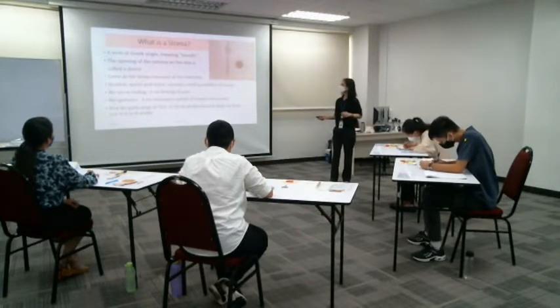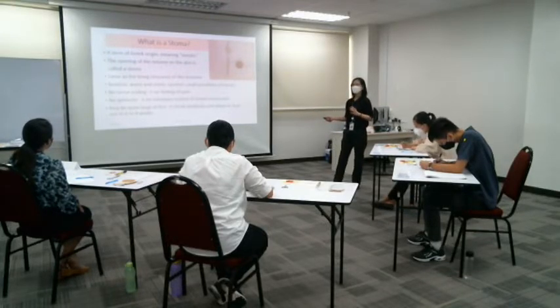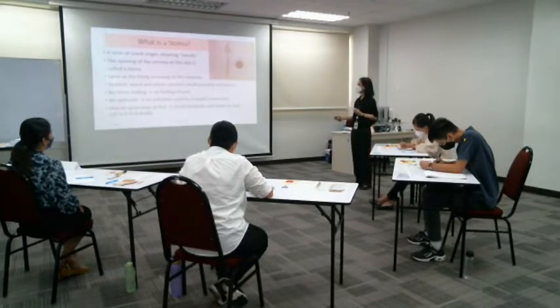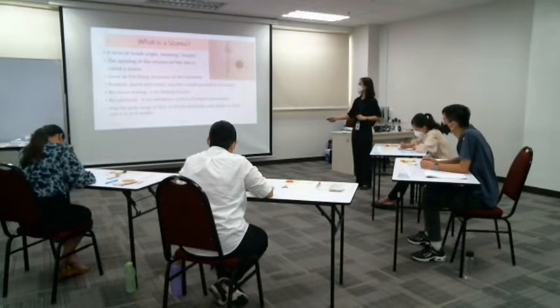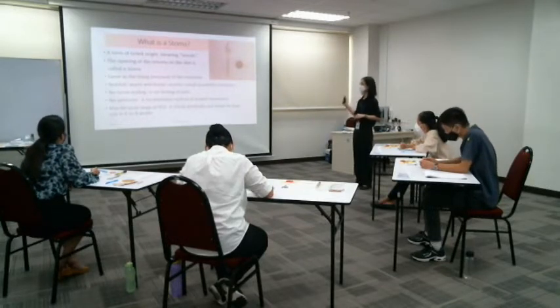The structure of it is the same as the inner lining of the intestine. It is reddish in color, so you can see clearly here. A very nice stoma, with reddish color, and it should be warm and moist, and it secretes a small amount of mucus. This is its normal function. And remember, in the stoma there is no nerve ending, so the patient has no feeling of pain when you touch it. This is an important point to take note of.